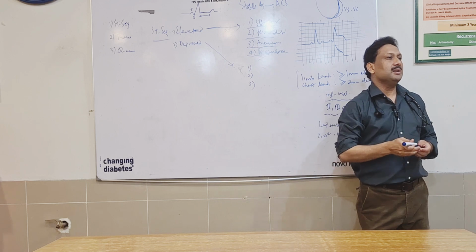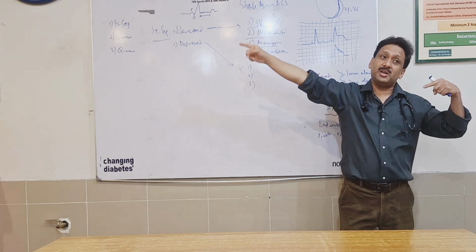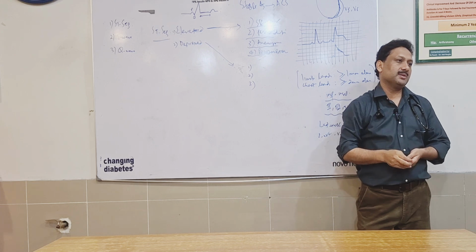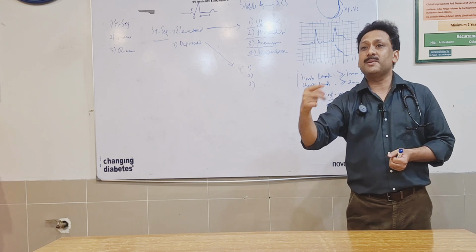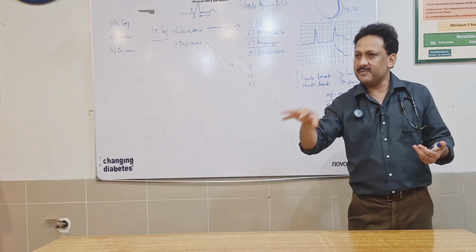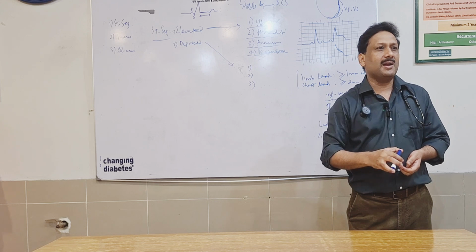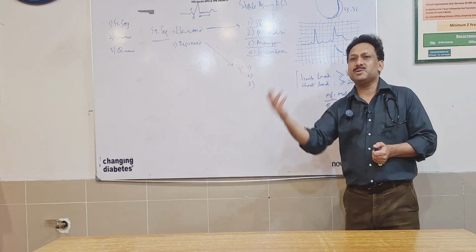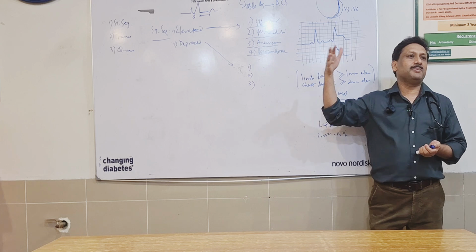In such a person, the symptoms will not be there. The ST elevation on the ECG which he had 1 year back will persist because of his aneurysmal formation, right? So an asymptomatic patient with such elevation, and then you would do something next as well, because you may come across a patient who is not symptomatic but is having myocardial infarction. That is always a possibility. Like in the setting of diabetes, a lot of people have silent myocardial infarction. So you would also get his enzymes done, and you would also get his echo done, and then you would come to know that this is because of aneurysm, and that elevation will persist for the life of the patient.